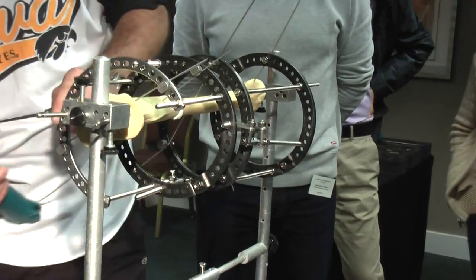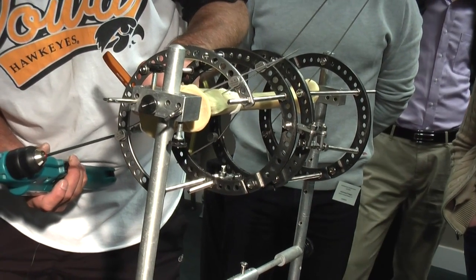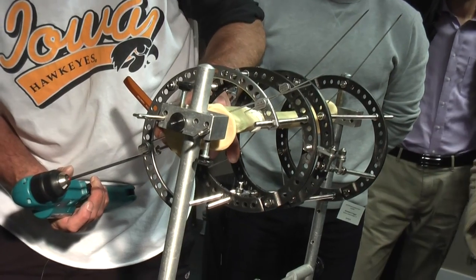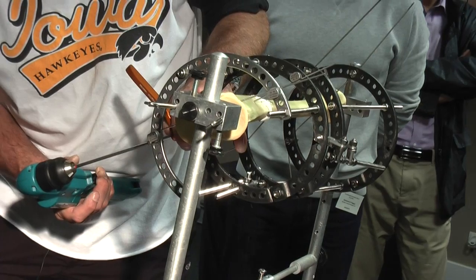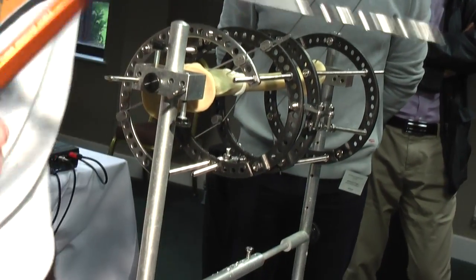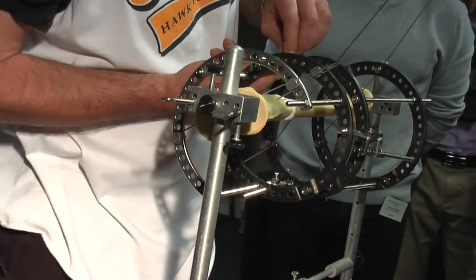Now, like we were saying this morning when Badri was talking about techniques for dividing the bone, it probably doesn't matter a hang how you do this. But sometimes in these sawbone models, the plastic, the stuff for joining, is actually incredibly tough. So you can pull like mad and it won't move.